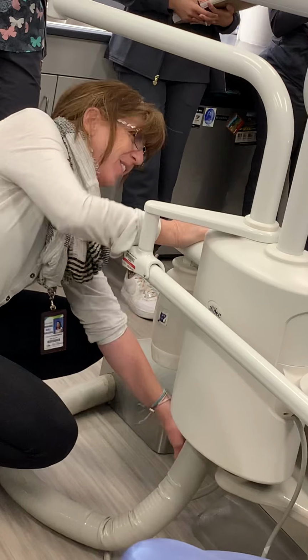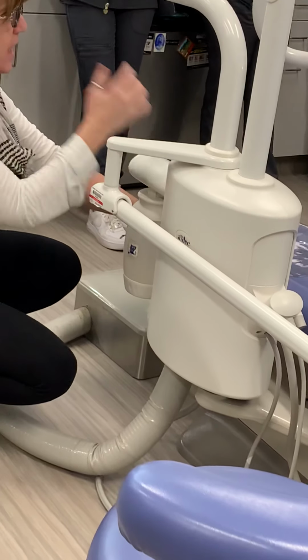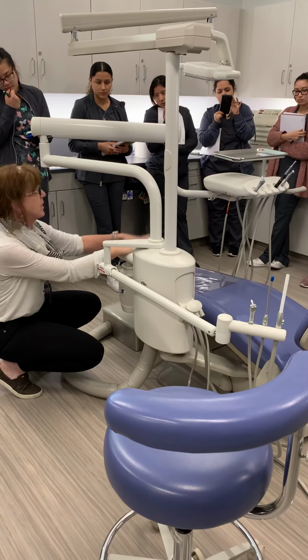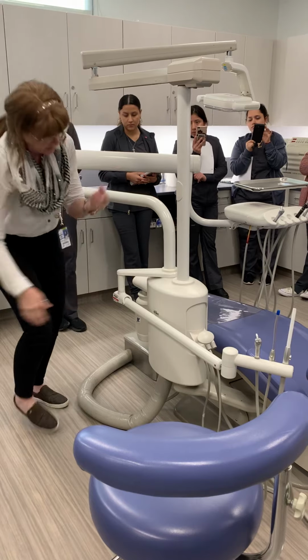There you go. This is the base, and you want to make sure the green light is always steady. If it's not steady, it means you guys lowered the chair or the whole thing down too far, or it's compressing on a cord. So if it's blinking, it needs to go up a little bit.